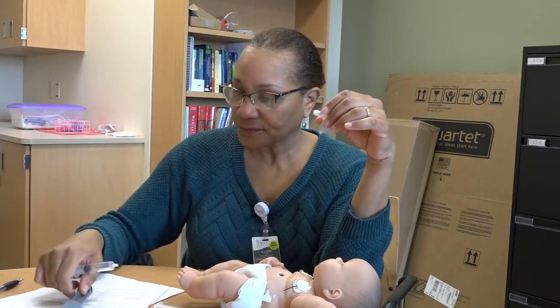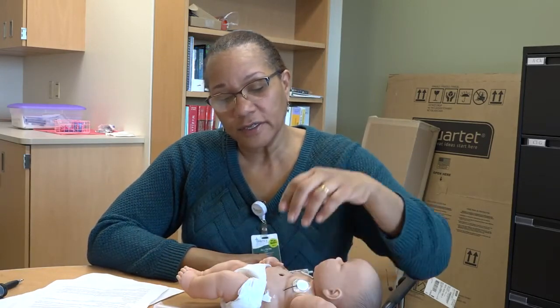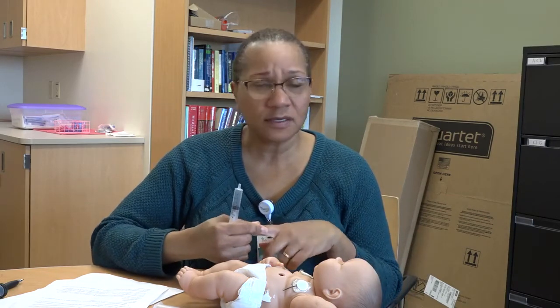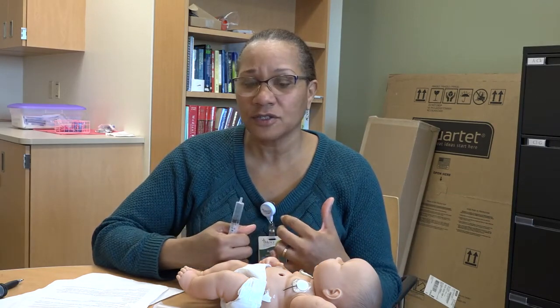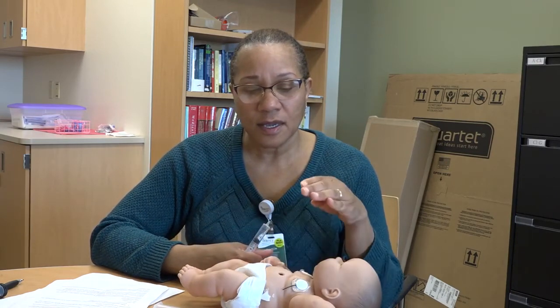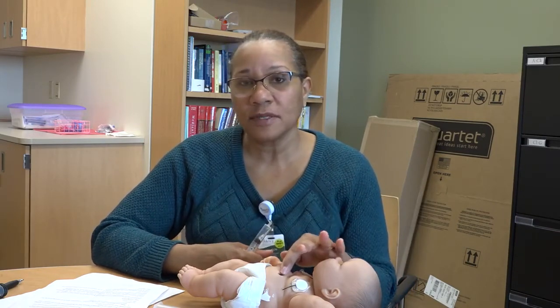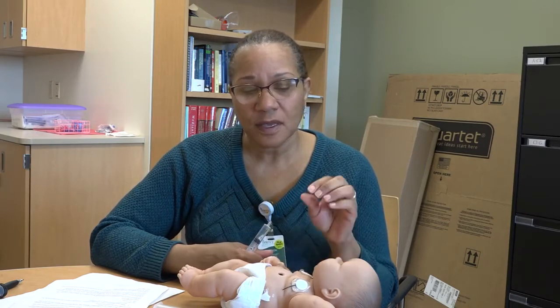So, checking the volume is going to be one of the interventions if we're seeing more leakage from the G-tube side. The second thing that can cause more leakage is granulation tissue. Granulation tissue is normal healing tissue, the same way when anyone gets a cut and our tissue knits and heals together, that's by granulation tissue. So we've created a wound here for the baby, and the body is doing what it's supposed to do. It's trying to close that hole. It just so happens that we want this hole to stay open.